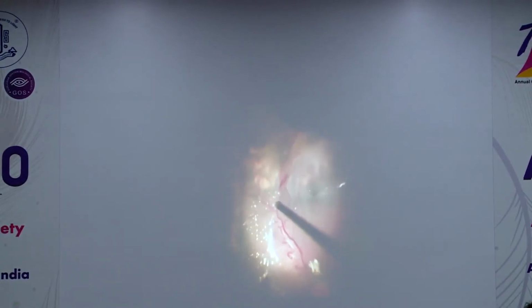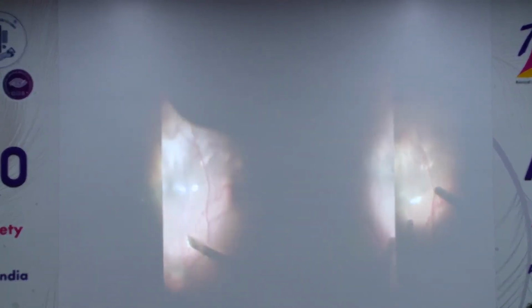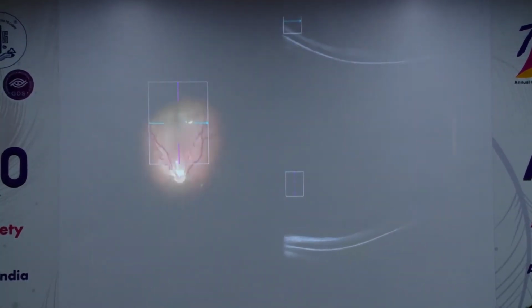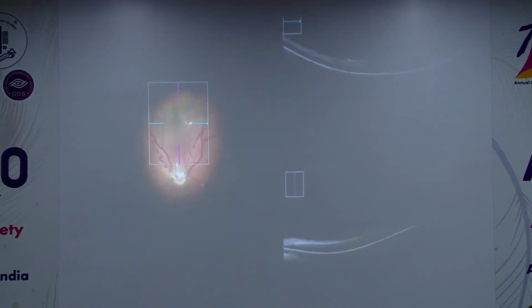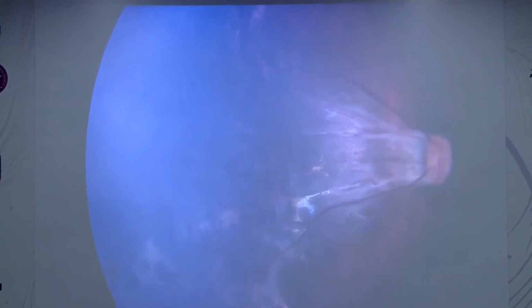Further removal, especially on the temporal side, risked creating an iatrogenic break due to the densely adherent hyaloid and lifted retina. The attachment of the posterior pole compared to the preoperative image could be visualized on table, and the same was confirmed with microscope integrated intraoperative OCT. The case had a good outcome with attached posterior pole 6 months after the procedure.